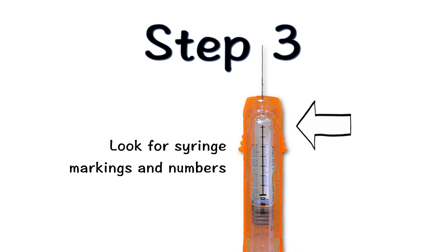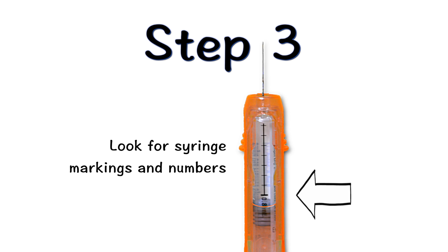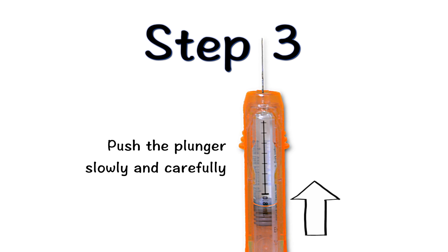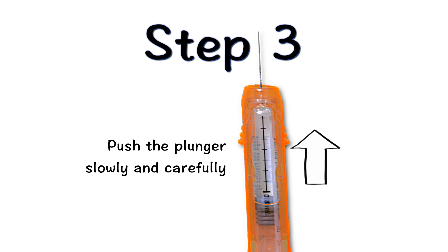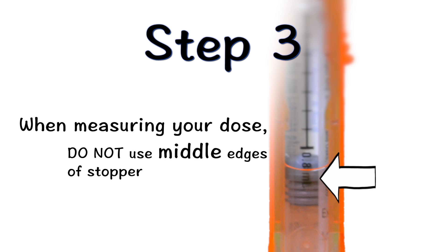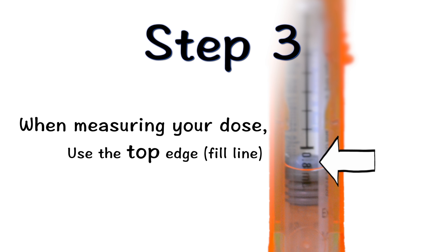Make sure you can easily see the syringe markings and numbers. Then to adjust, push the plunger slowly and carefully until the top edge directly below the dome of the grey rubber stopper is even with the line that corresponds to your prescribed dose. Do not use the top of the cone or the middle or lower edges of the grey stopper to measure your dose. Use the top edge fill line.